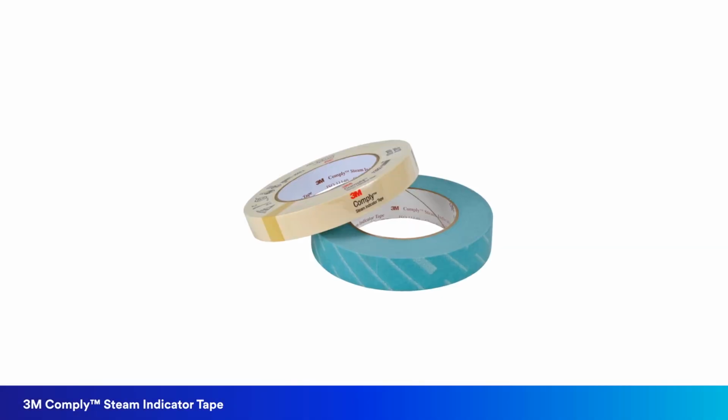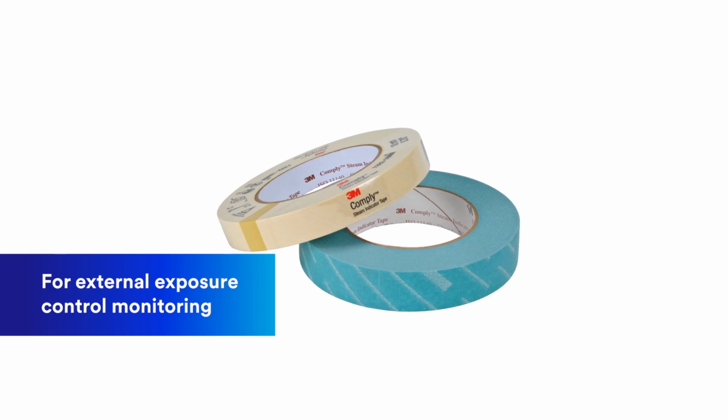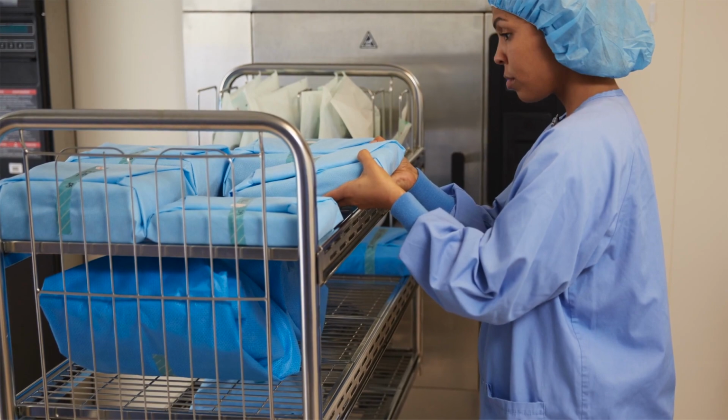Now let's focus on indicator tape. Indicator tape is an example of a type 1 chemical indicator used for external exposure control monitoring. Type 1 chemical indicators change color when exposed to sterilant. They are used to indicate that units, such as packs, have been directly exposed to the sterilization process. Tapes help you quickly distinguish between processed and unprocessed items.